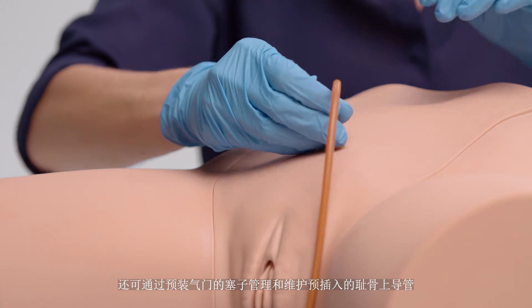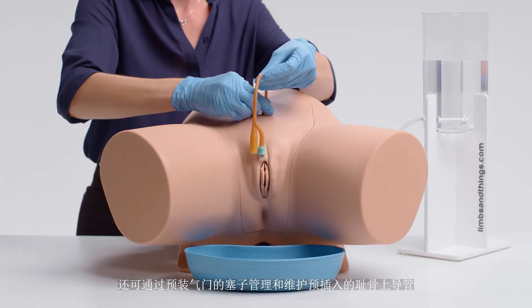It also allows for management and care of pre-inserted suprapubic catheters via the pre-ported bung.